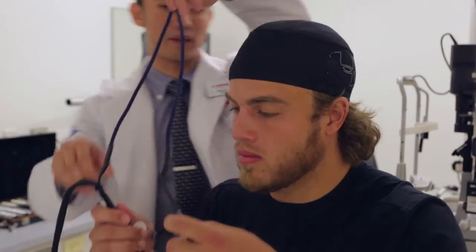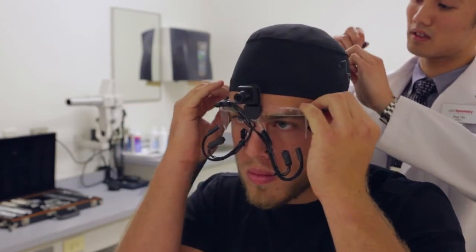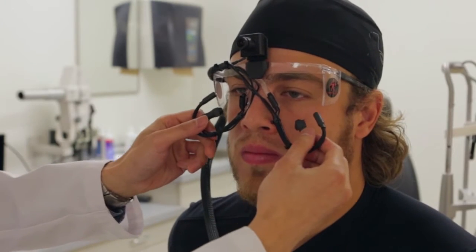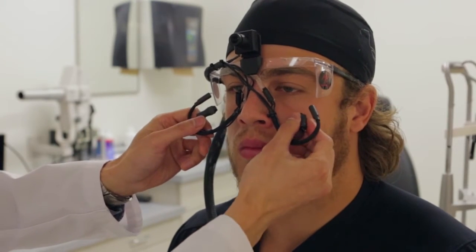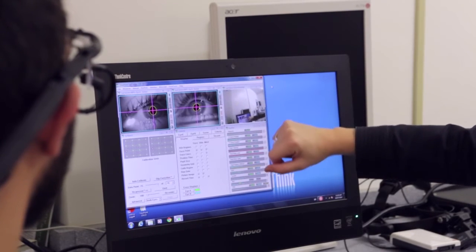The last piece of big equipment we use is an eye tracker. It allows us to track where the athletes are actually looking — the position of both their eyes as well as what they're looking at. There are three cameras on that system, and we can have athletes or anyone wear that when they're performing a task to see what they're looking at and how they're collecting the visual information they're using.